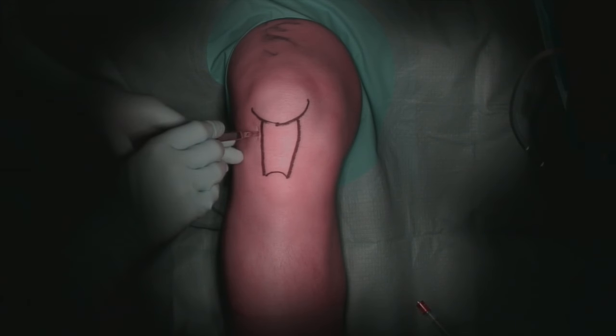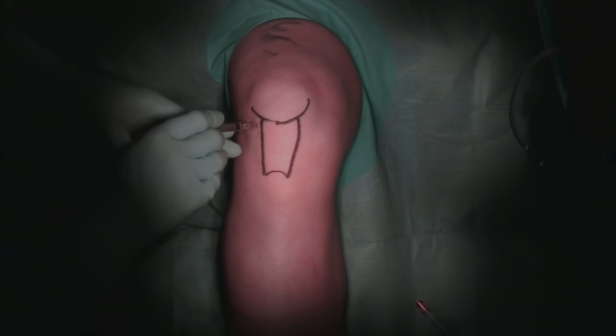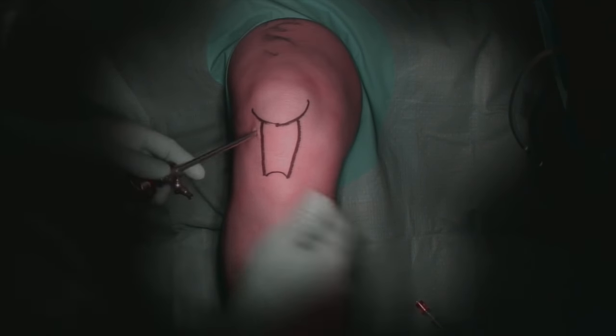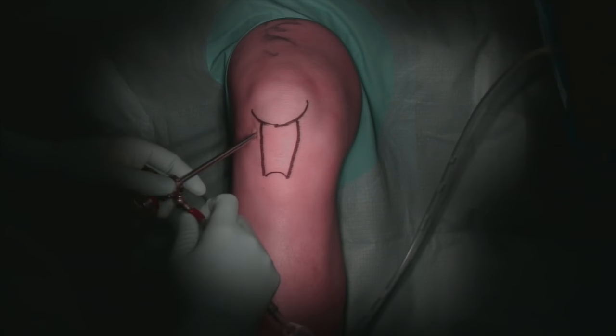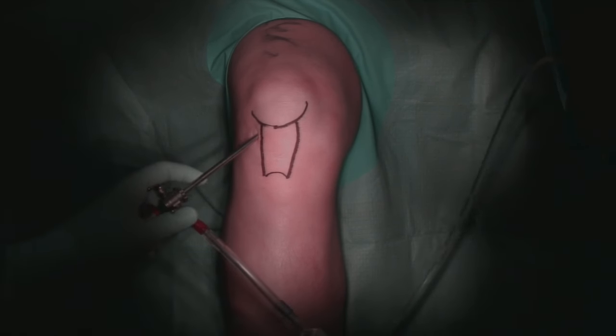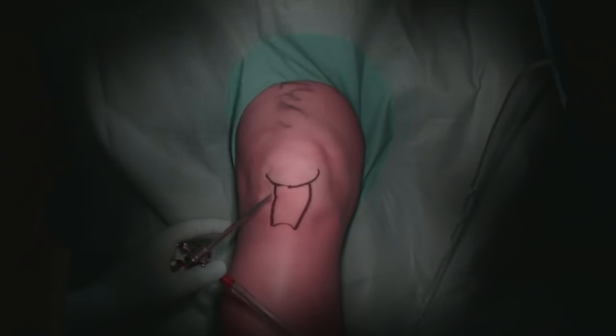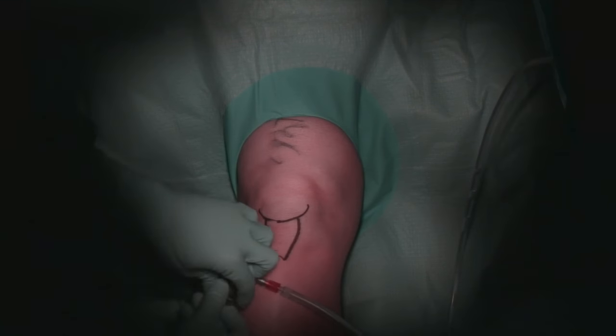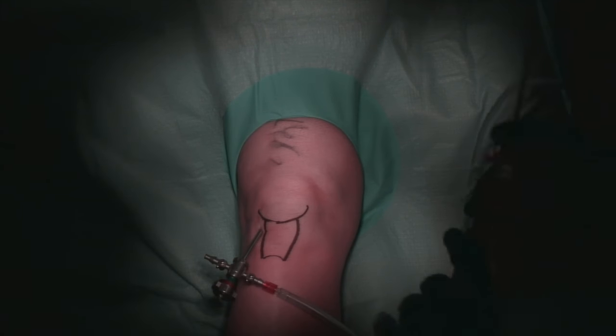An 11 blade is used to make the anterolateral portal and the arthroscopic trocar is introduced into the knee with the knee in flexion. It is inserted aiming the trocar for the intercondylar notch. The knee is then brought into full extension and the trocar advanced into the suprapatellar pouch. The obturator is then exchanged for the arthroscope.